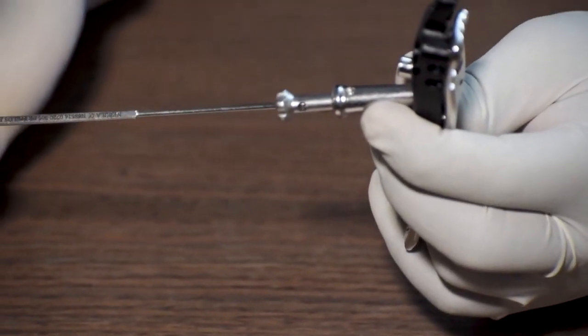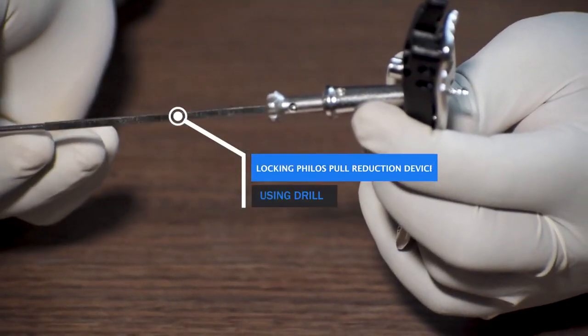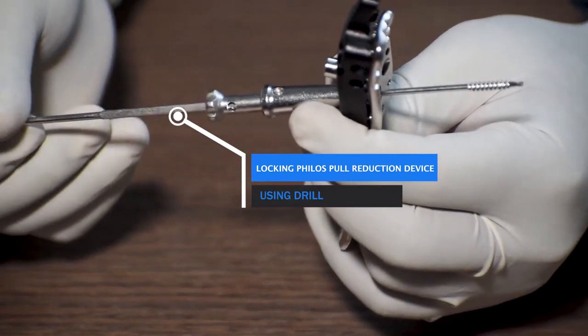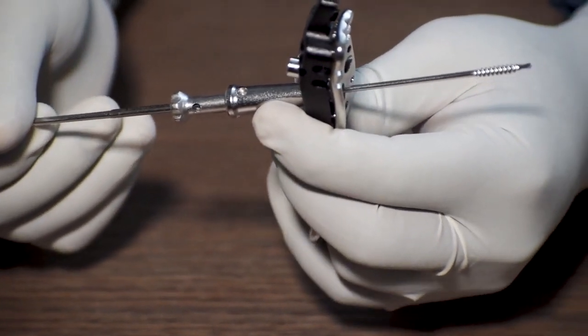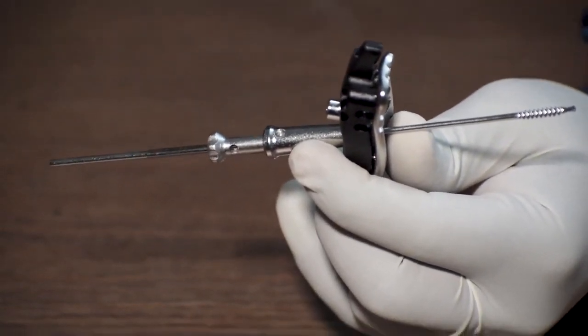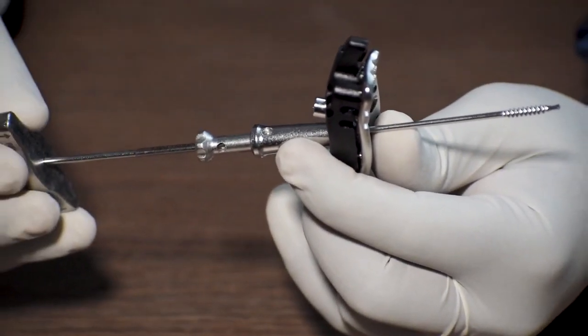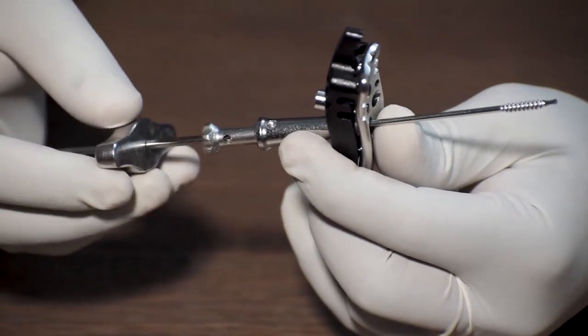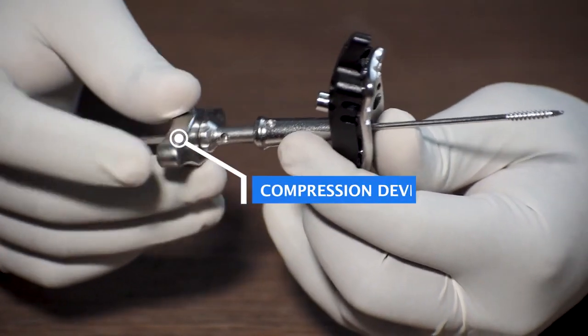Thereafter with the help of a drill, we will lock the Phyllos pull reduction device in the proximal part of the head region of the plate. Thereafter we will attach the compression device in this Phyllos pull reduction device.